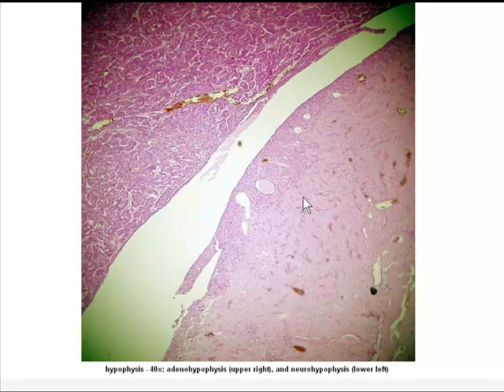Here is the pituitary gland, both the anterior or adenohypophysis and the posterior or the neurohypophysis. The difference in identifying the pituitary gland from the adrenal glands is, notice we have this nice break here in between the darker pink area and the lighter pink area.